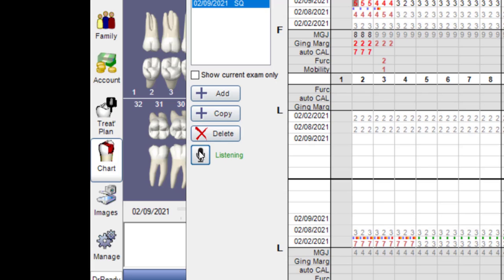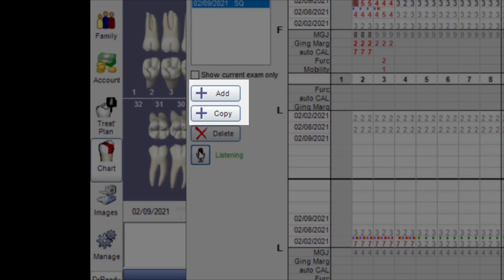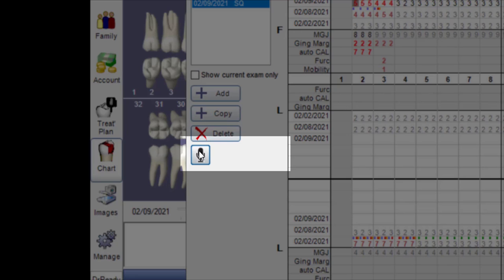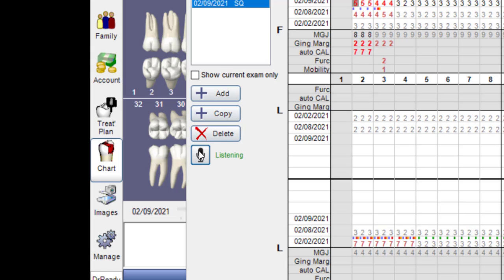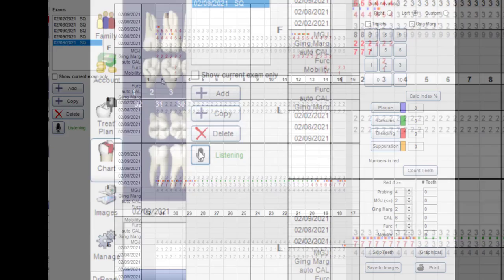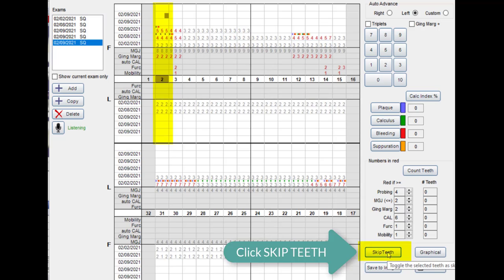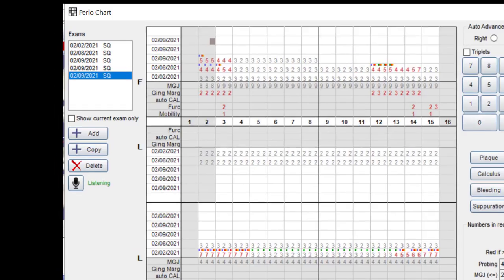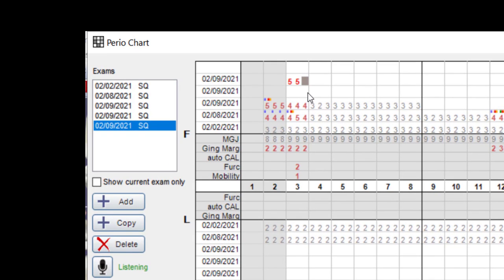The basic features of voice perio charting include adding or copying a previous exam, navigating through start, stopping, or pausing, skipping teeth, and commands for left, right, resume, backspace, and delete.